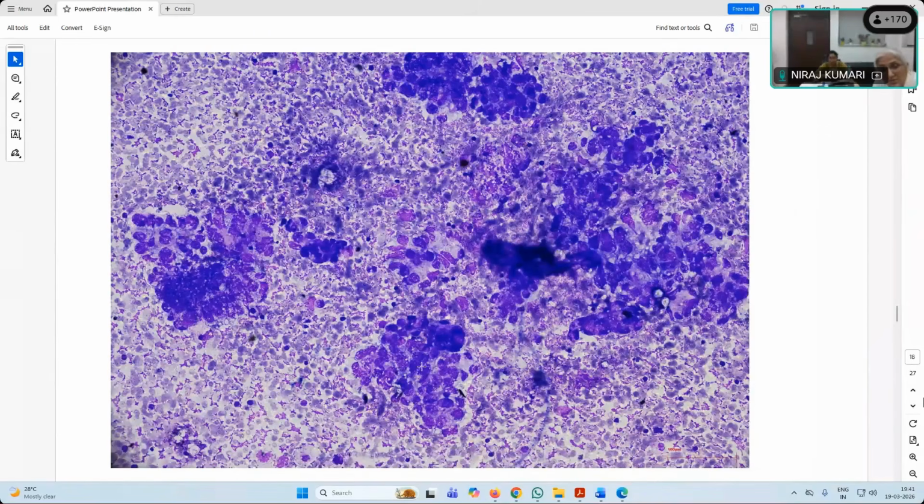Hepatoblastoma doesn't show cells like these, okay? And it will have at least moderate cytoplasm, and the cells will be polygonal or round. Here you don't see those cells. So if you see this kind of morphology, I think the germ cell should come first. Yes. In a 3-year-old.